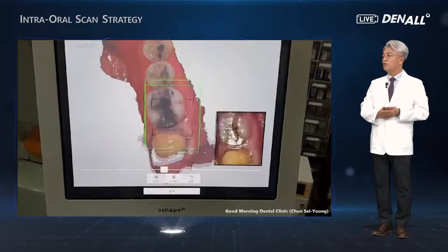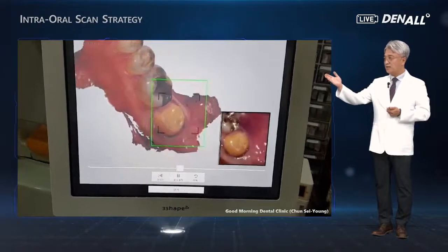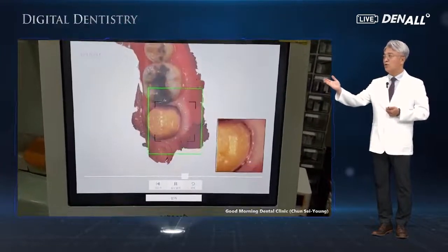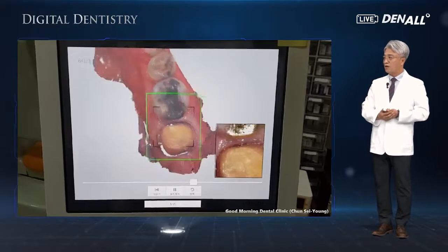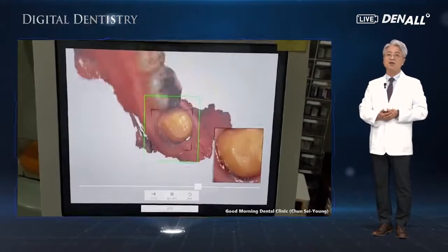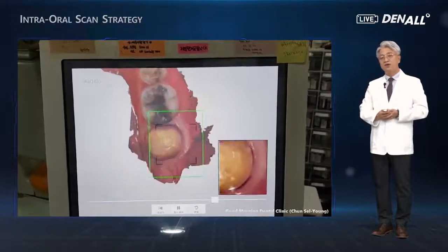Before scanning that portion, articulation paper is used to get articulation marks, and that is measured first. And the lingual and distal margins are not scanned properly, therefore the scanning should be repeated to get the clear margin in that part. So this required a lot of efforts.